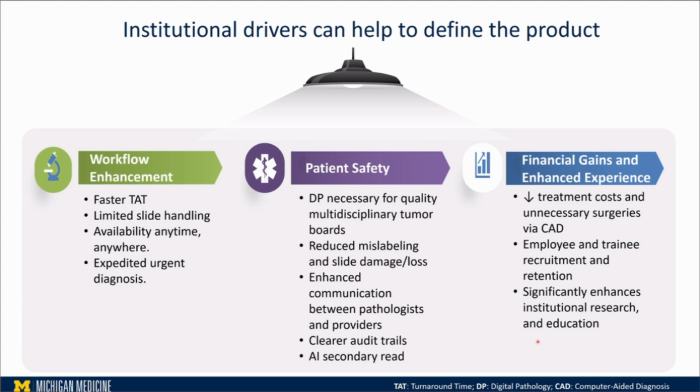For patient safety, you definitely need to reduce mislabeling and damage of slides, support multidisciplinary tumor boards, and make audit trails easy. And of course, maybe computer-aided diagnosis and the financial gains. Maybe the other thing is employee and trainee recruitment, retention, etc. So these are the things we used to define the institutional drivers for our institution.